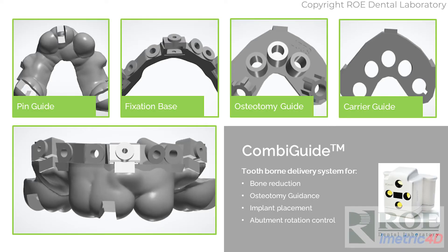This type of case is part analog and part digital. By analog, we mean a physical guide system that manages the bone reduction and manages the implant site drilling and implant placement. Freehand dentistry, although most prevalent and popular, often in full arch cases misses a few things — one of those being an adequate amount of planned bone reduction. With our combi guide and other guided bone reduction services at the laboratory, we can predictably provide the proper amount of vertical space for long-term prosthetics, which is really the key.